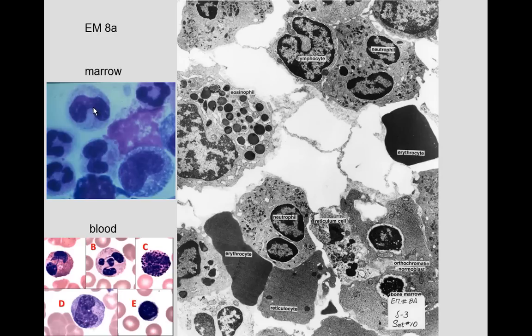Reviewing bone marrow, we can see different phases of neutrophil development. In the blood itself you see only mature neutrophils, but in the marrow we see the developmental stages. We also see lymphocytes, erythrocytes, orthochromatic normoblasts about to extrude their nuclei, reticulocytes as precursors to red blood cells, and a developing neutrophil with a lobulated nucleus and granules.